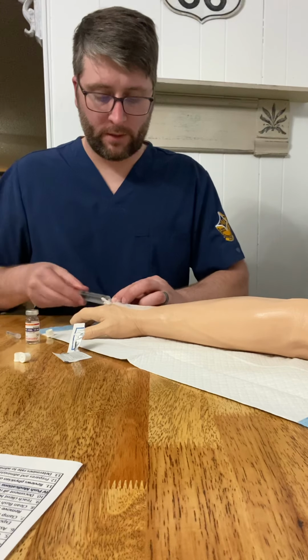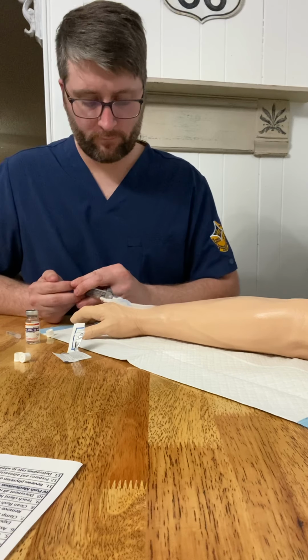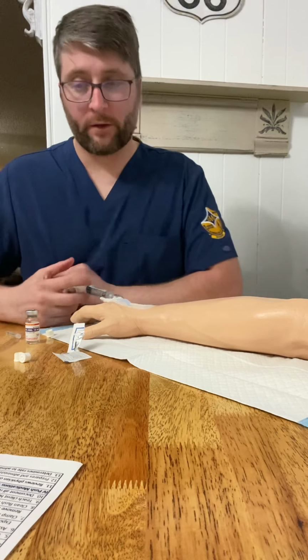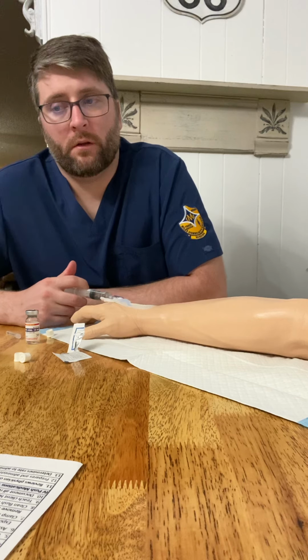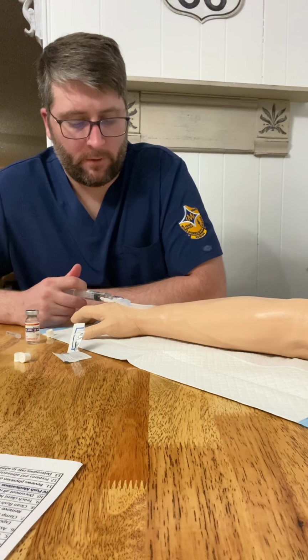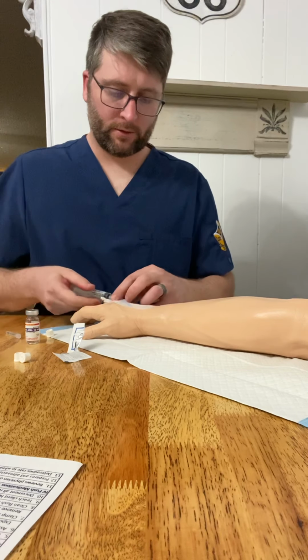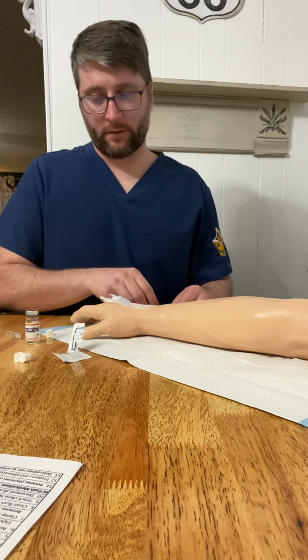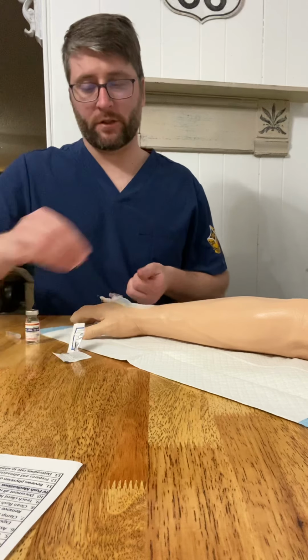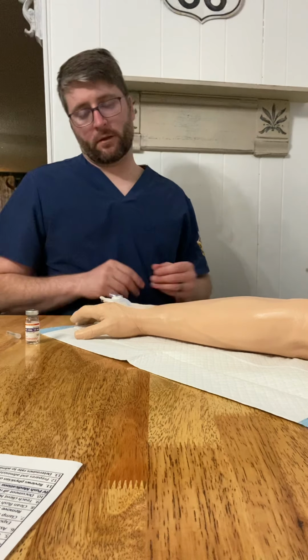And then we're going to flush with another 5 milliliters of saline. Flush all that. Look around, make sure the patient's tolerating that. Then throw that away, and then we're going to clean up all our stuff as needed. Dispose of our sharps in the sharps container.